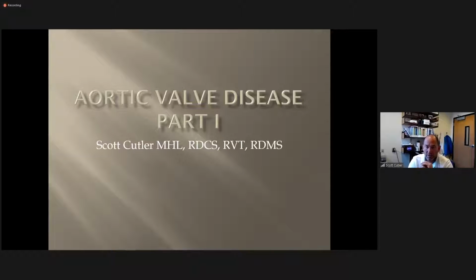So there's techs all the time that miss disease processes just because they throw up a picture of the tricuspid valve, not deliberately going after what's happening on the valve. So a good tech is going to be surveying and looking for those things. If we don't see it, we typically will just go into a nice picture of the valve and show that. But remember, your shadowing and everything like that can also limit or minimize the evidence of that pathology that's there, because that little bit of shadow can hide a leak. It can hide other things. So the tech has to be deliberate to make sure that they are in fact showing the real structure and the complete structure. And then keeping in mind that although we're looking at a three-dimensional valve, I'm only showing you one slice of that valve, one very thin slice.